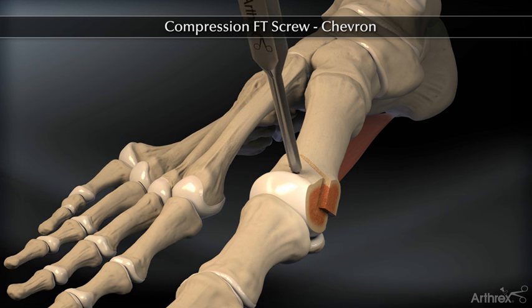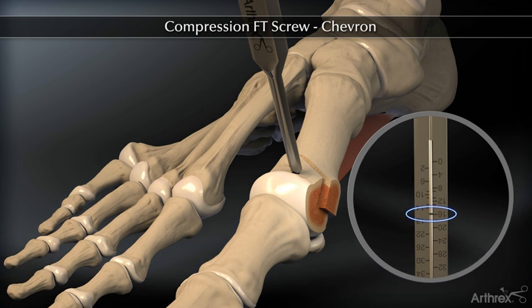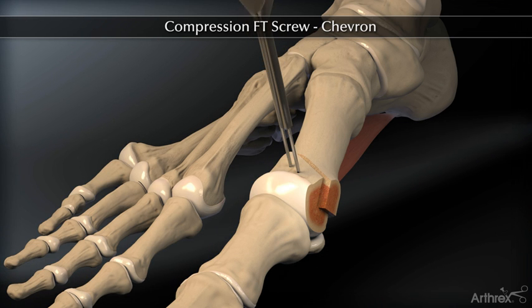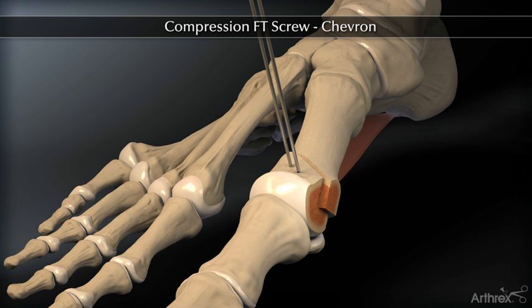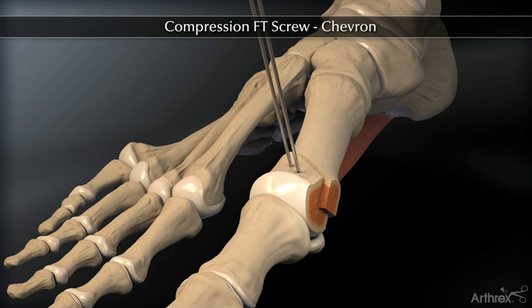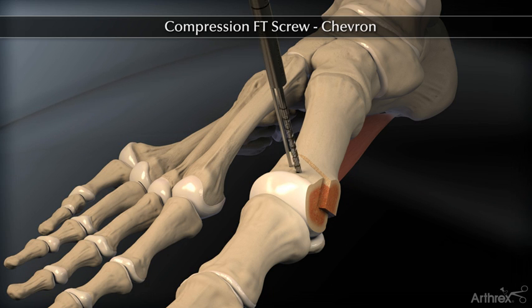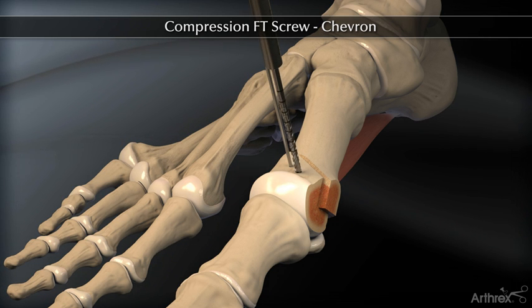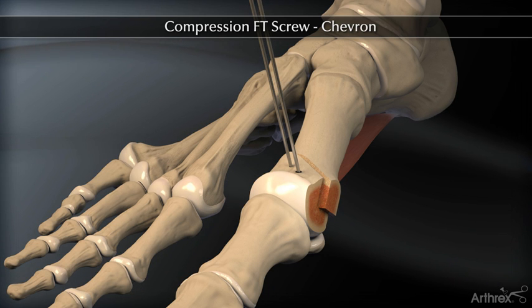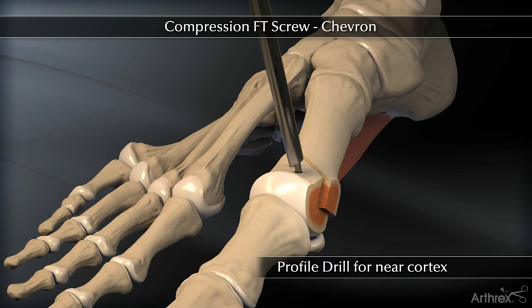Measure the K wire with the depth measuring device. Next, advance the K wire through the distal cortex. Drill the entire bone fragment with the 2 mm cannulated drill. Overdrill the near cortex with the profile drill.